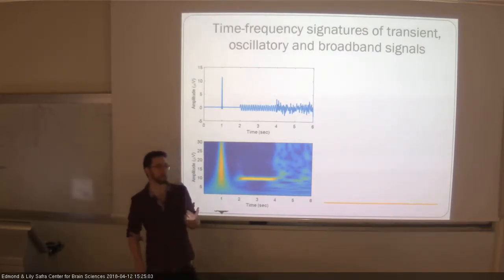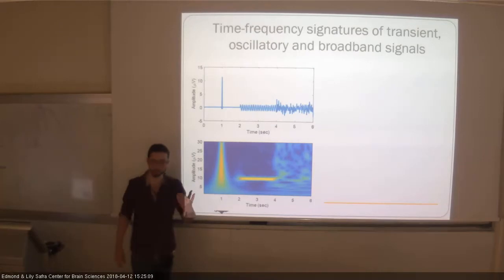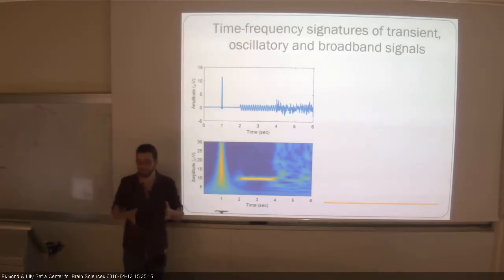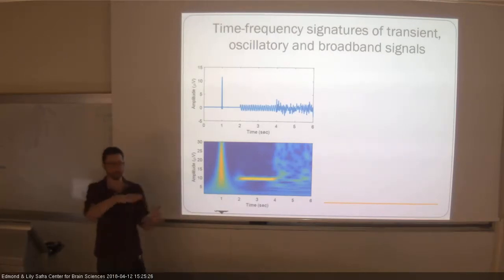There's no proof. I mean, you could say that maybe this oscillation is not real, that there's no actual source in the brain that behaves this way. It's just a coincidence in how different areas of the brain, maybe like a series of delta functions, each area has a spike, and somehow they correlate in a way that in the EEG signal it looks like an oscillation.